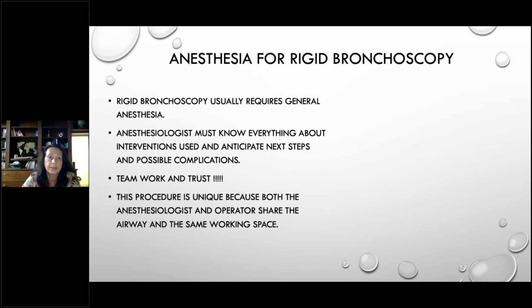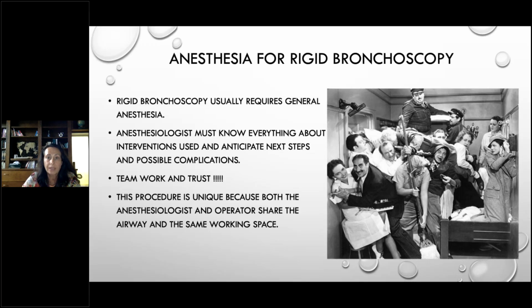One of the reasons for that is because we're all working in the same space. We're all very close to each other, and sometimes getting in each other's way. And I don't know how many of you work in teaching institutions, but in our institution, when we're doing bronchoscopy, and especially rigid bronchoscopy, it looks like this. Here's the person doing the bronchoscopy, here are the supervising attendings, and there are 25 different people observing. And here's the anesthesiologist trying to see what's going on with the patient.